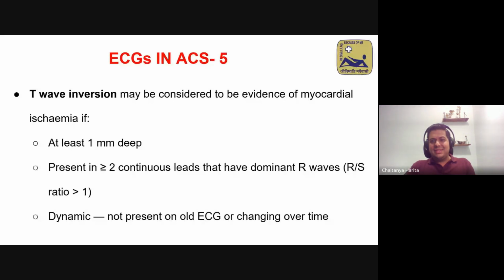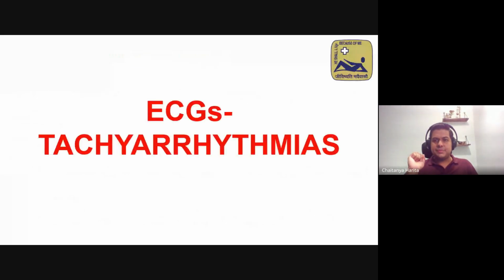Why do I say that? Because you have certain patients who may be asymptomatic with T wave inversions. You evaluate them, it comes normal. But if they have ongoing cardiac symptoms with T wave inversions, never neglect them, because these T wave inversions could be indications of a deeper problem. So you have to be very, very careful when you look at T wave inversions.